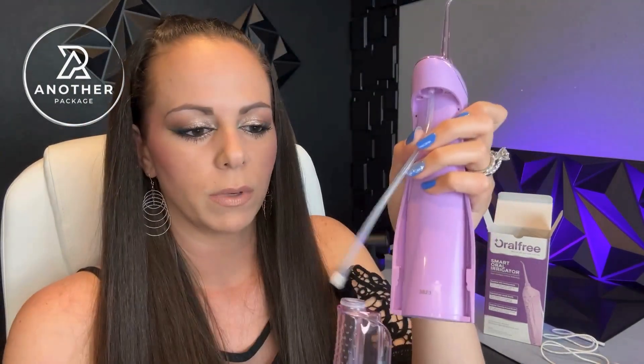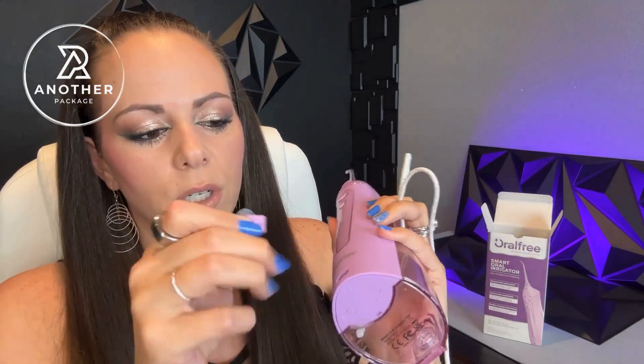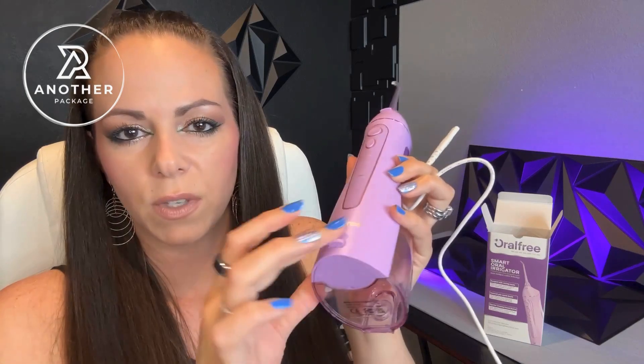You put the water in here — this just slides off completely — and I really like that the tube goes all the way down to the base of the water reservoir so it can get all of the water. You don't have to worry about having to refill it. It does come with a pretty unique charger, so you're going to want to make sure you don't lose this one, and the charging port has a little cover you need to remove and don't lose, because it's not attached.